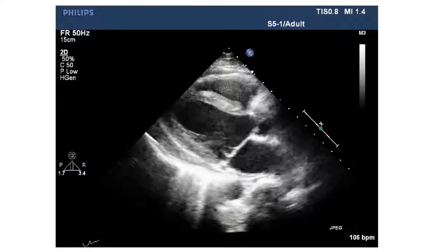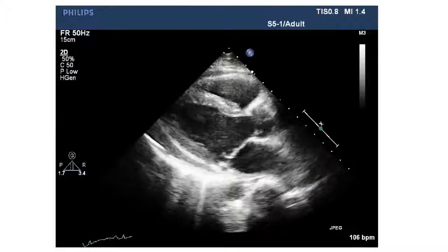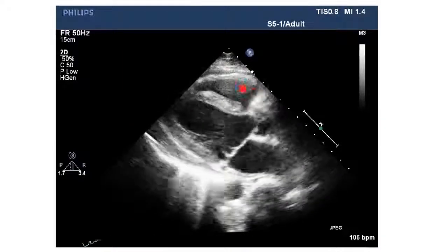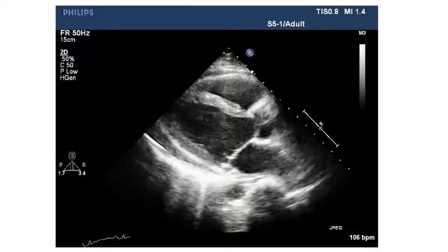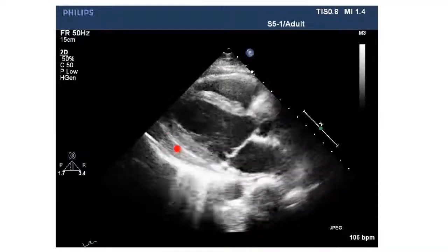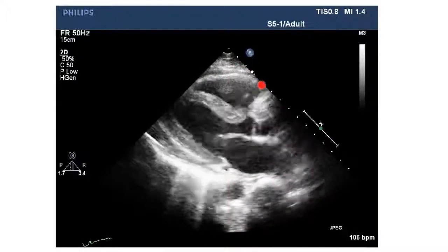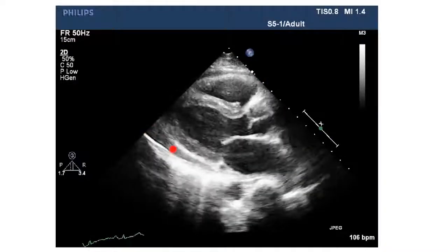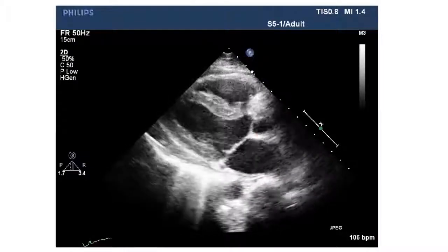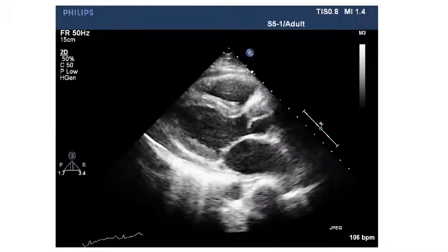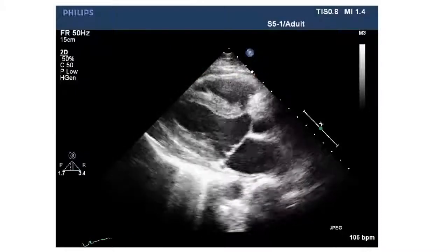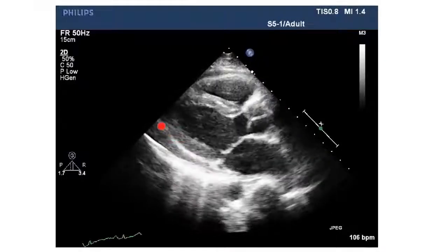This is the parasternal long axis view showing the left atrium, left ventricle, aorta, mitral valve, aortic valve, interventricular septum, and right ventricle. There is thickening of the pericardium around both the inferolateral wall of the LV as well as around the RV, and there is some mild amount of pericardial effusion. The interventricular septum shows a shuddering or bouncing motion, and because of this thickened pericardium, the underlying myocardium looks to be restrained.